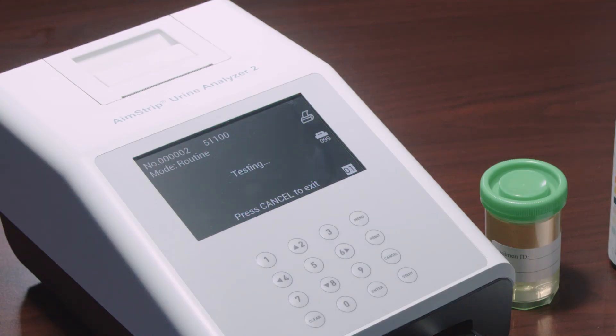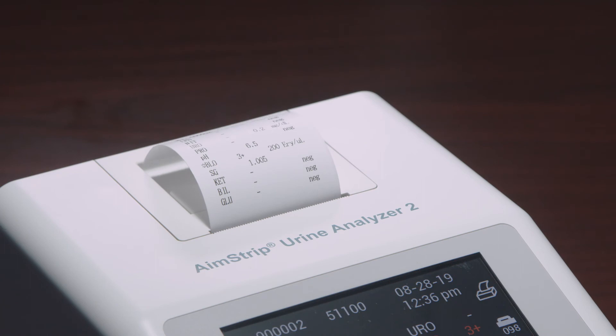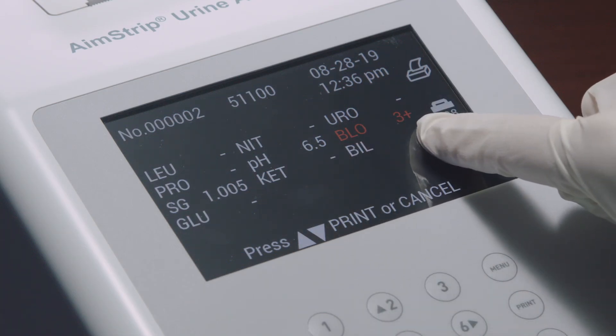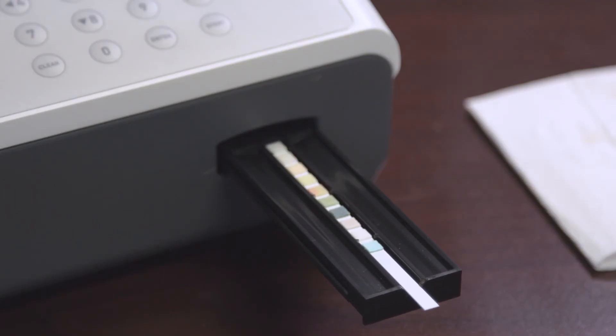When the countdown clock reaches one, the strip holder will carry the strip inside the analyzer and begin testing. The results will be displayed on the screen and stored in memory after each test. If Auto Print is on, the results will be printed automatically; any abnormal results will be highlighted on the screen and flagged on the printout. Remove the used strip from the strip holder when the strip carrier moves out, and discard it according to local regulations.